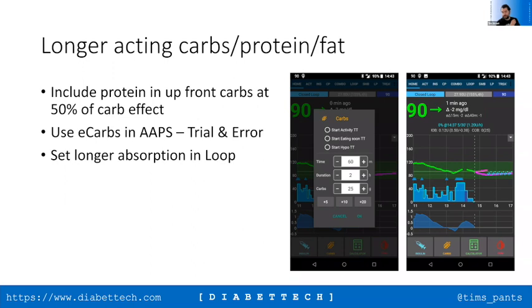The key thing to look at is, is it increasing basal rates? Yeah, that's what I mean. It can go up to 500% basal, and then only afterwards it might use SMBs, but sometimes it doesn't do that, even when her level's quite high. So what are her basal rates like? Sorry, you cut out there. Our internet connection's rubbish. Are your basal rates very small numbers? I think the maximum is 0.48 or something.